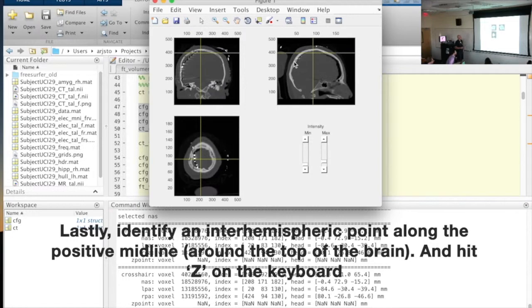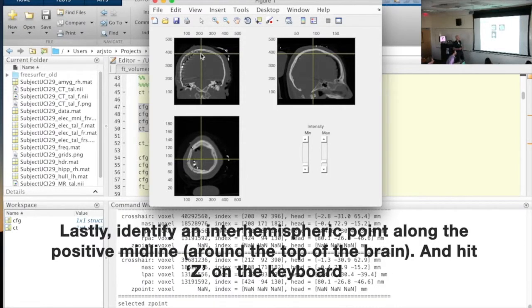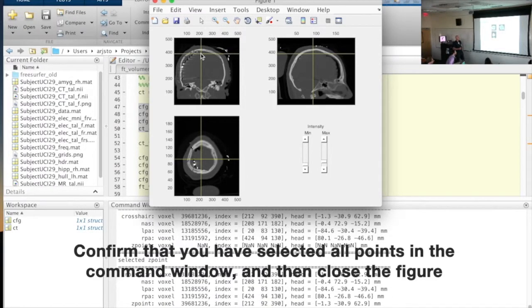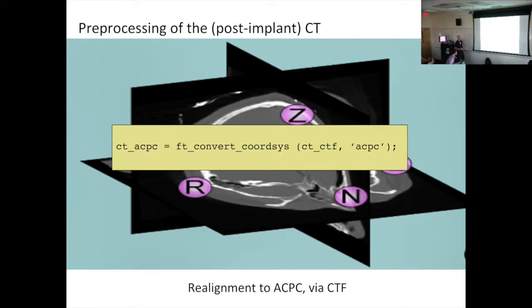Hit R. And the nasion. This is at the root of your nose, right here. And then, again, a midline point hitting Z. Okay, you want to check that you have all coordinates here, all landmarks, nasion, left, right, and Z. And now your CT scan is in CTF space. It's not in ACPC space yet, but you can call FT_CONVERT_COORDSYS, which will do an automatic conversion. And you give your CT as input in CTF space, this is your target coordinate system, and you'll get your CT out in ACPC space.